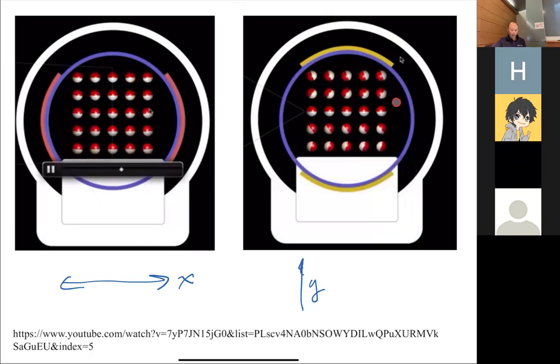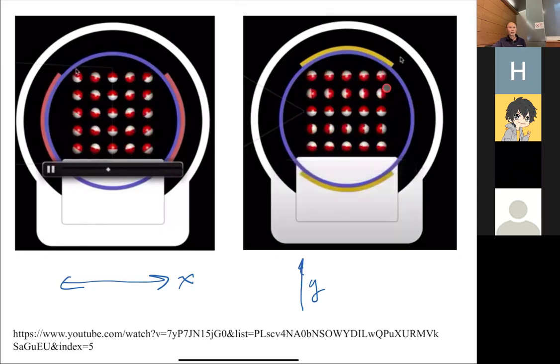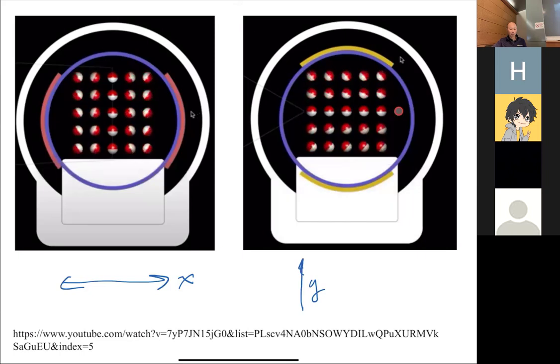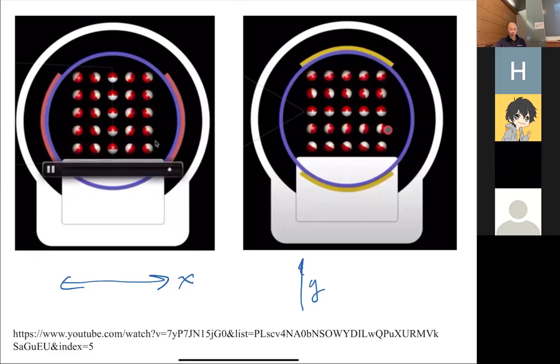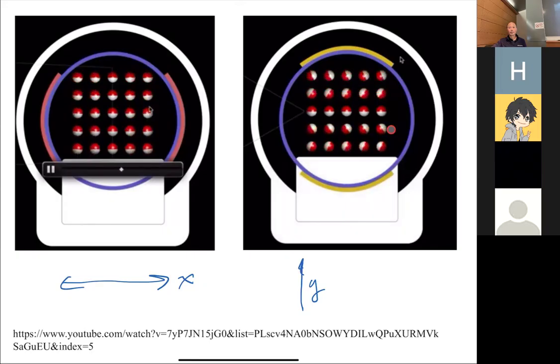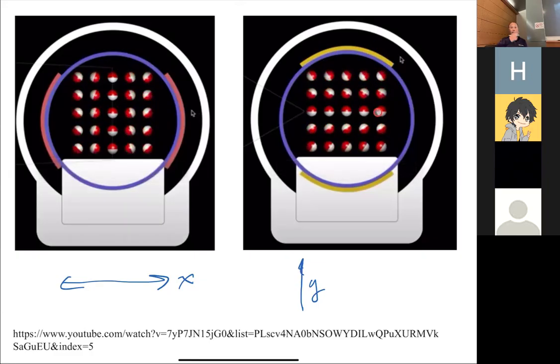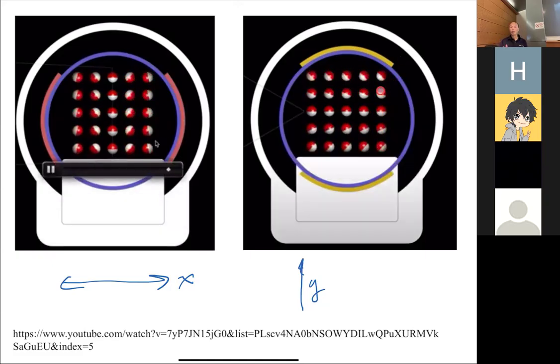So here's a question. Which are spinning faster? Are the ones below or the ones above spinning faster? Like where is the gradient stronger, where am I adding more field? Below or above? Below, right? Yeah, because these are going clockwise with respect to these guys, so they must be precessing faster. And these are going counterclockwise, so they're relatively going slower.